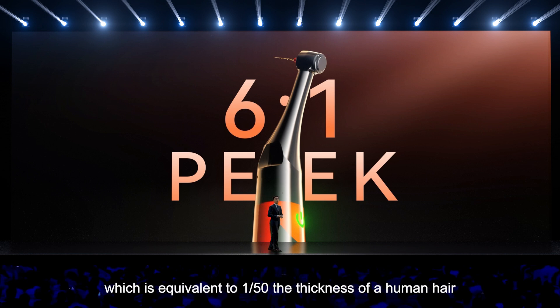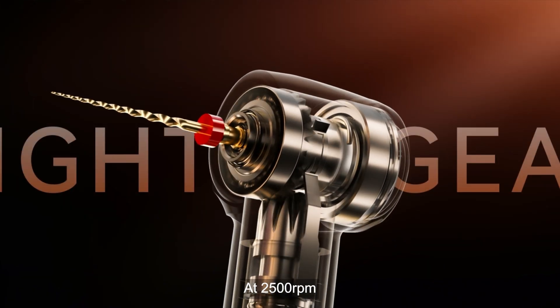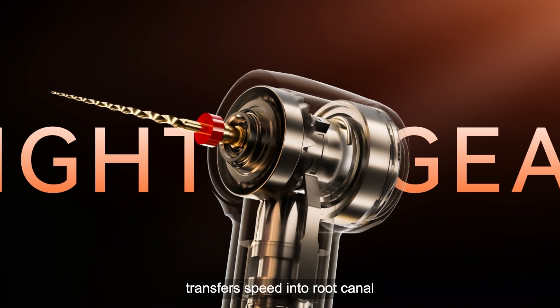That is equivalent to 1/50 the thickness of a human hair. At 2,500 RPM, the Smart 8 Pro's precision-engineered contra-angle transfers speed into the root canal without any energy loss.